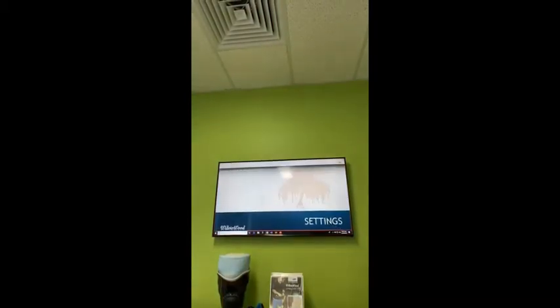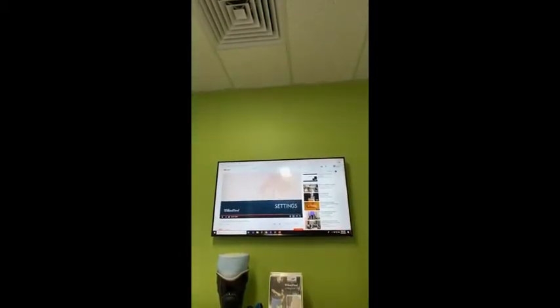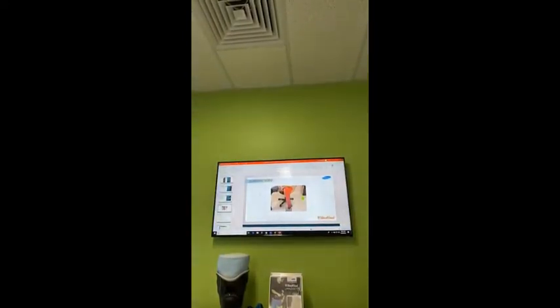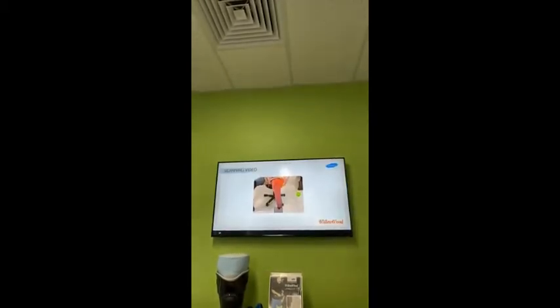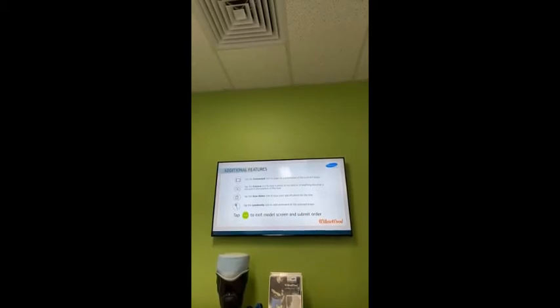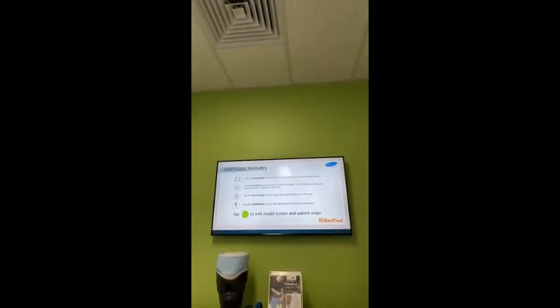Okay, so that just covers the scanning app and the Design Liner app. So we'll go back to the PowerPoint presentation now. So basically the video covered everything in these few slides, so we'll skip through these slides and yeah, we'll find the video is a lot more self-explaining than the slides.